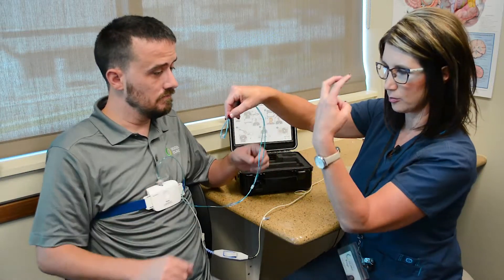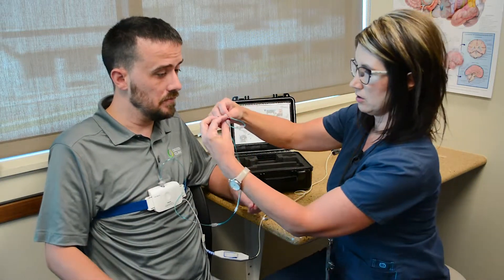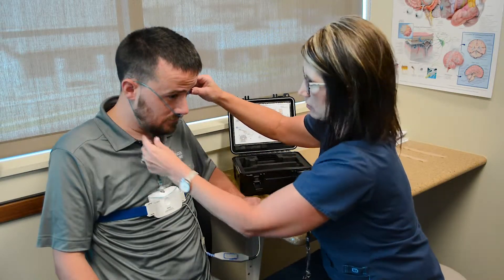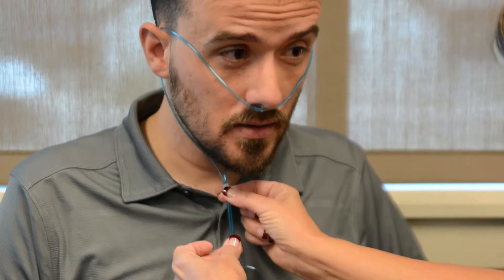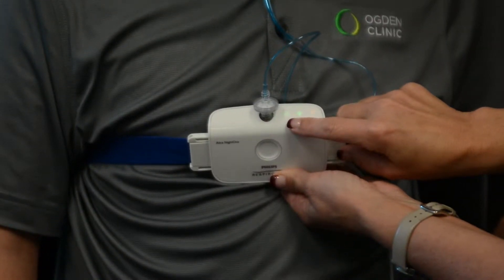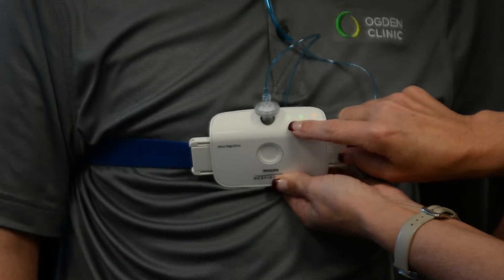The prongs are bent, so they go backwards in your nose. You're just going to put this in your nose, around your ears, and then just tighten this up underneath your chin. We'll get another green light saying that the sensor is on and reading.